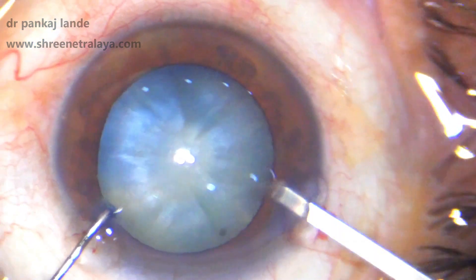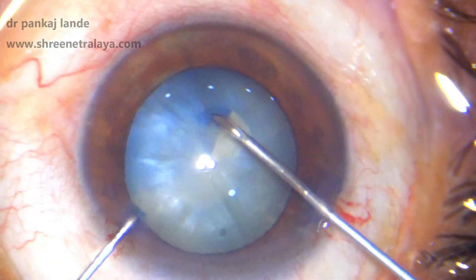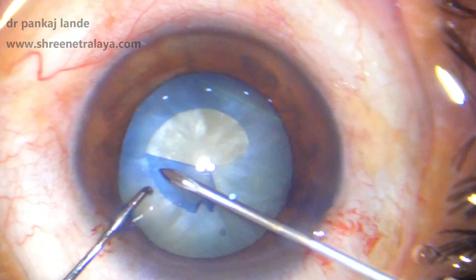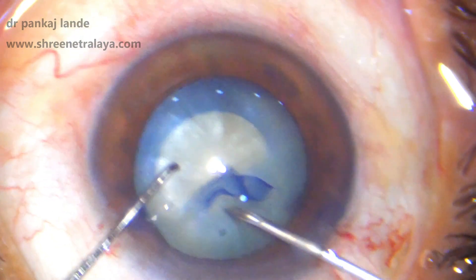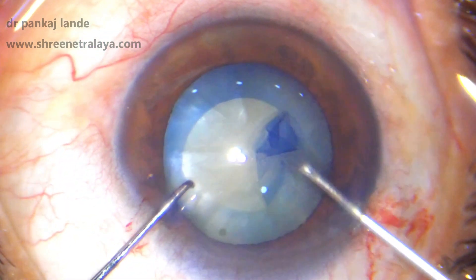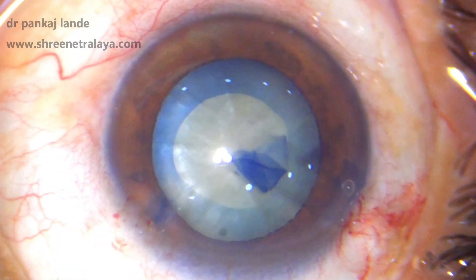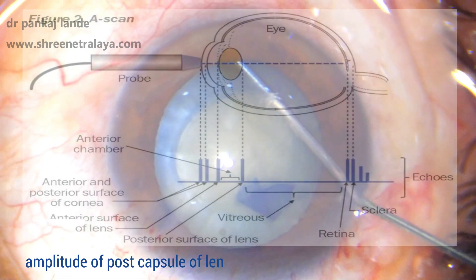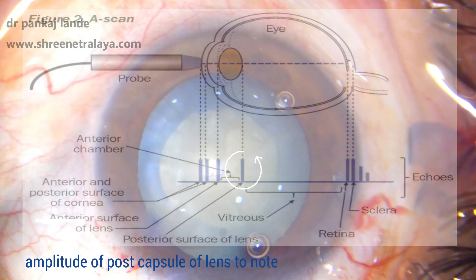After staining, the anterior chamber is filled with viscoelastic and rexis is completed with cystitome needle. I always have capsule forceps in my hand in case of a runaway rexis. Hydrodissection is done with a 27 gauge cannula. It is debatable whether to perform hydro in cases of mature cataract, as you may have a posterior polar cataract which is white and mature.